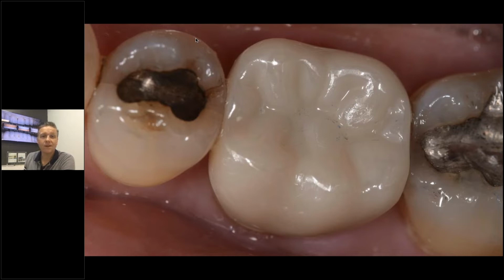And I would not say that would be a very aesthetic result. It is a very functional result. The crown fits perfectly, contacts are spot on, function is great, occlusion is good. So that patient definitely gets his problem solved: there is maybe a cavity, we do a preparation, or the dentist does a preparation, and we solve the problem with the crown. But for me, that is nothing aesthetic.